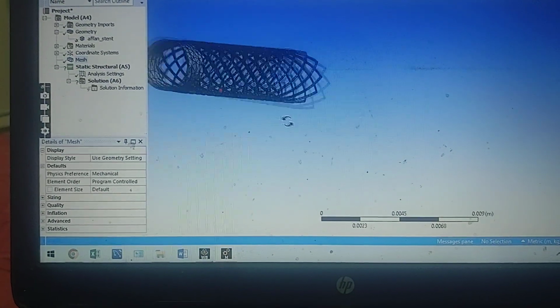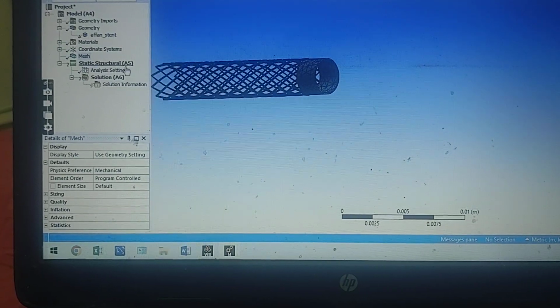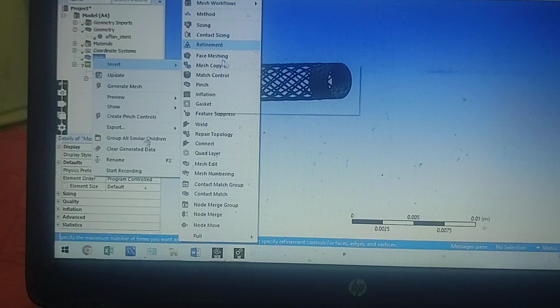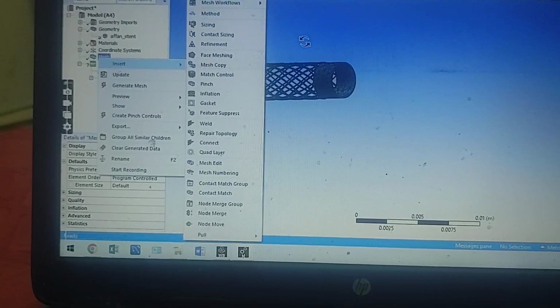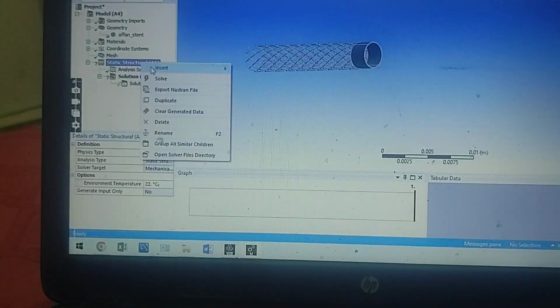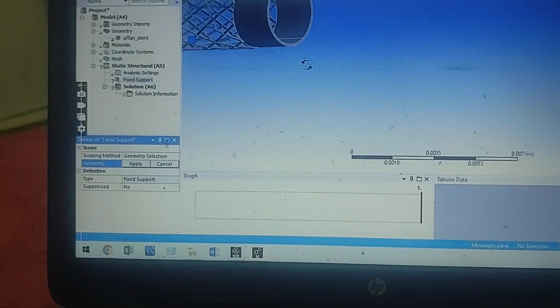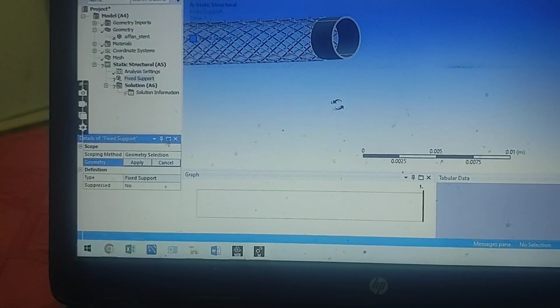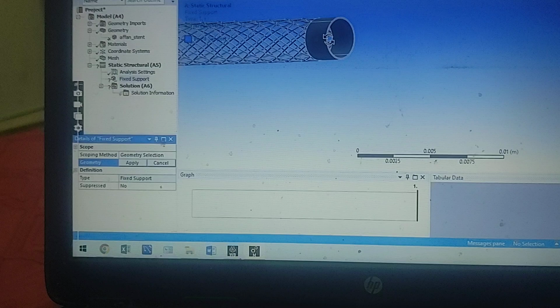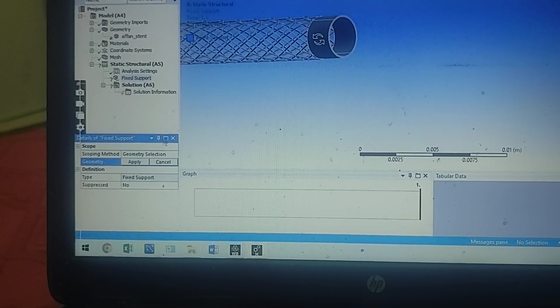Click here for mesh. I am meshing by keeping the default parameters. You can change the meshing parameters. Right click, insert refinement, face meshing, contact sizing, method, or any other type if you want. Then go to Static Structural A5, Fixed Support. This is a basic simulation. Okay, my mouse is not capturing any face. I click Fixed Support but cannot apply it to any face.